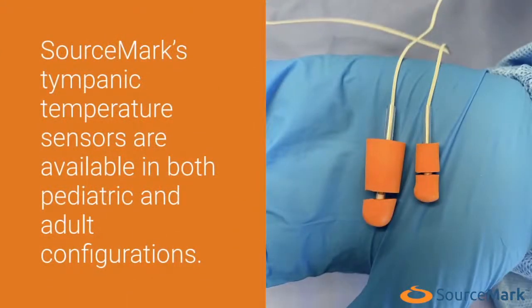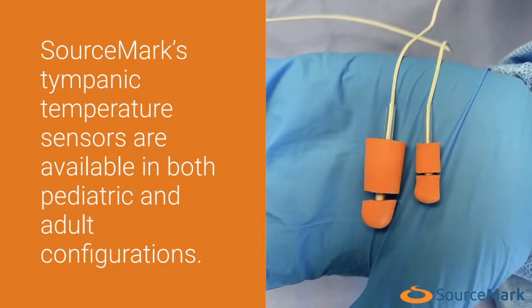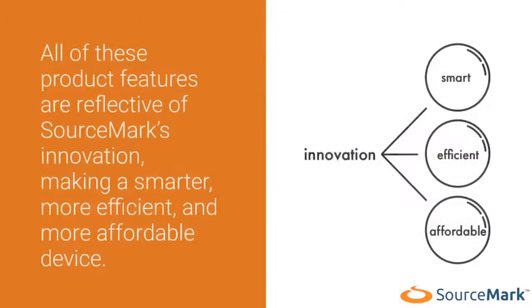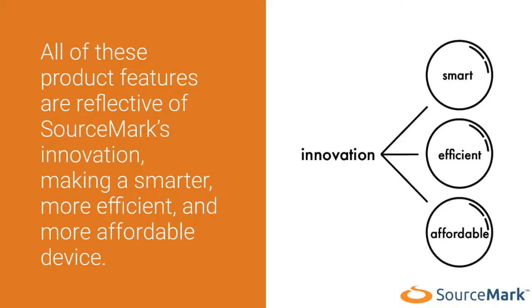Sourcemark's tympanic temperature sensors are available in both pediatric and adult configurations. All of these product features are reflective of Sourcemark's innovation, making a smarter, more efficient, and more affordable device.